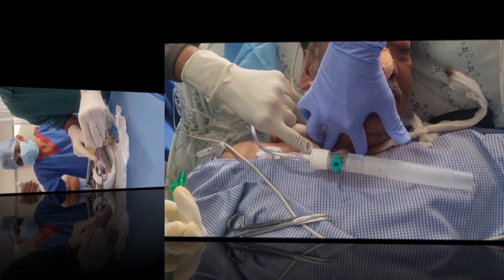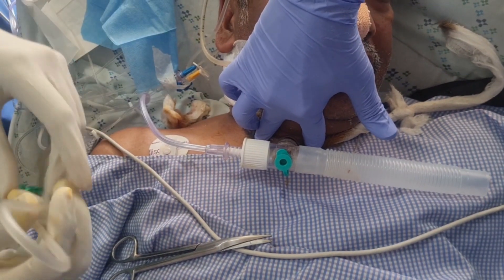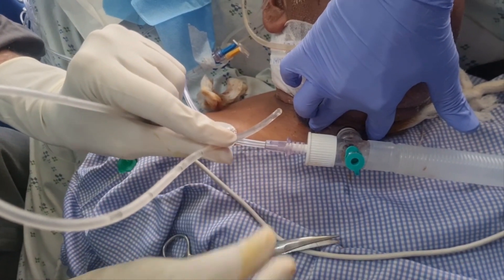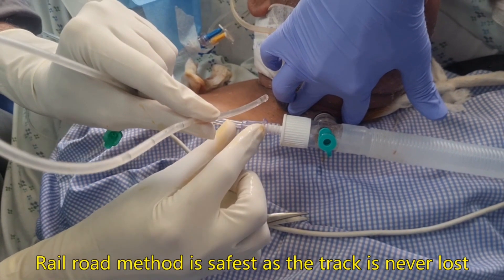The most comfortable and secure method is railroading, where we put a suction canula inside which acts as a guide wire. On this suction canula, we remove the old tube, and on the same suction canula we reinsert the new tube.